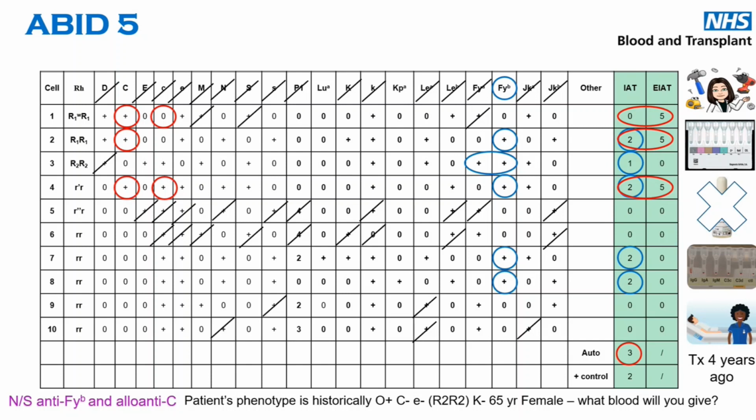Then I'm just going to continue on and click away just for speed, because I'm aware that it's nearly 2 o'clock. So I've got a Duffy B here, but we haven't excluded everything because there's something going on by enzyme. Hopefully you've got the same that I have. So this is where you start to match your patterns up.